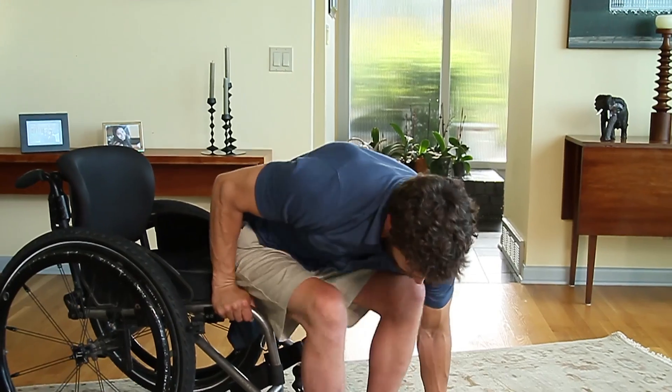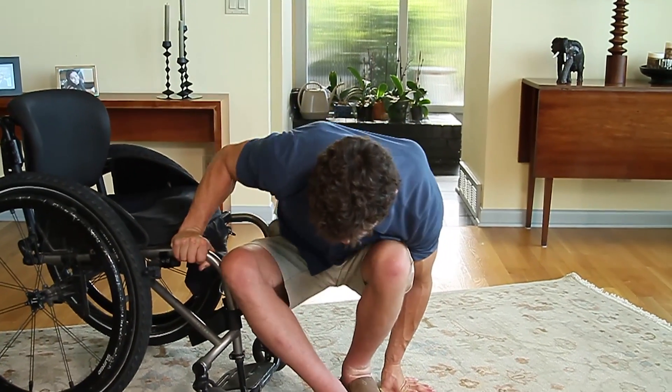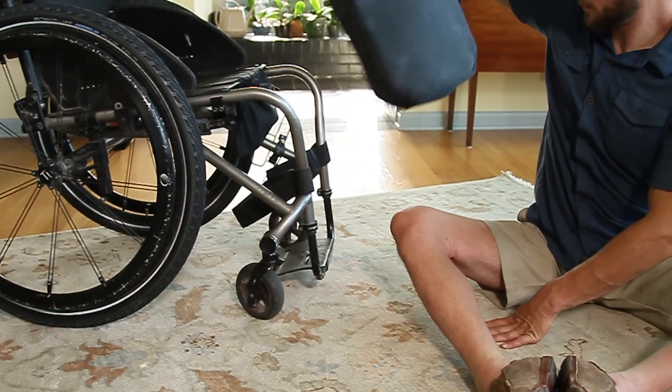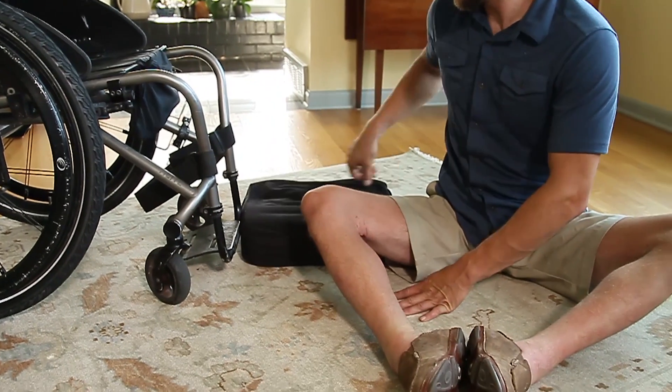While propping on your hands, slowly lower your hips from your seat diagonal to the floor. Pull a mat or your wheelchair cushion underneath you to protect your skin if you're spending time sitting on the ground.